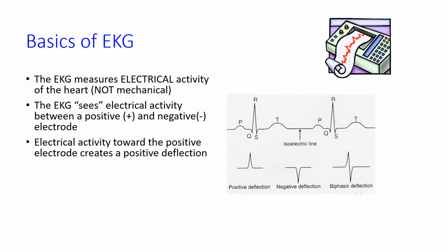So we are looking at the basic EKG. Please remember, when you're looking at an EKG or ECG, it measures electrical activity only. You cannot look at an ECG and think that patient has a pulse, because sometimes there's electricity going on in the heart, but you may not have an actual mechanical activity, which means a pulse. So you would have to feel for a pulse.